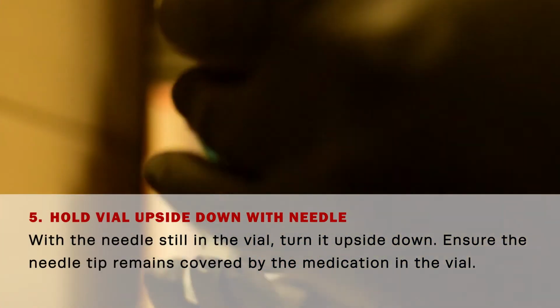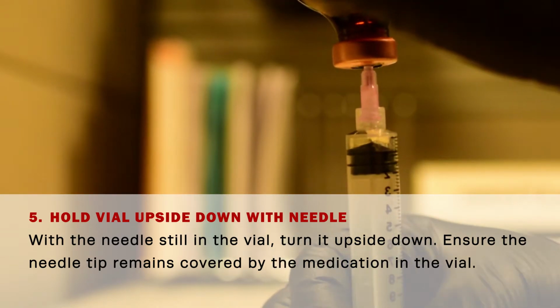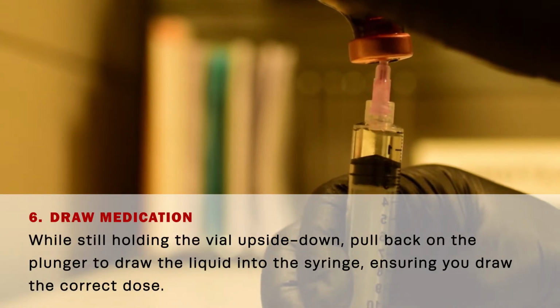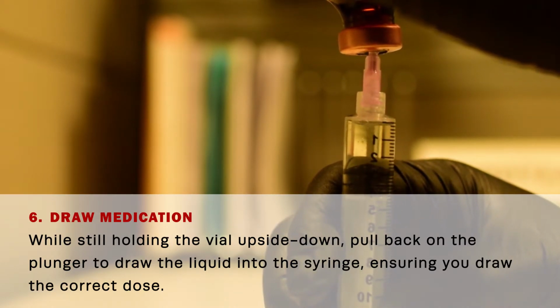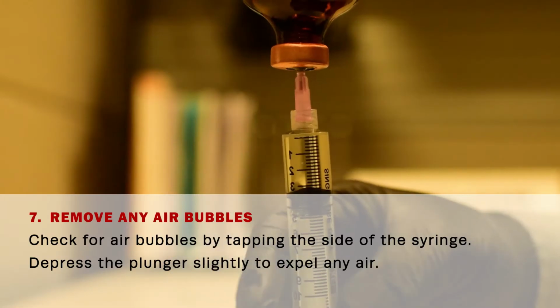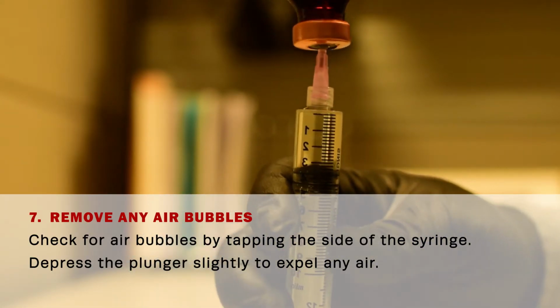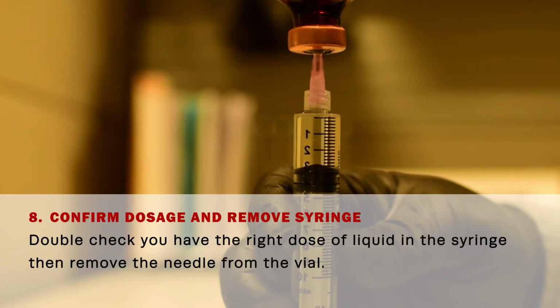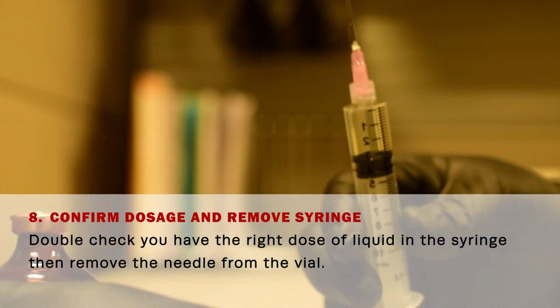With the needle still in the vial, turn it upside down. Ensure the needle tip remains covered by the liquid in the vial. While holding the vial upside down, pull back on the plunger to draw the liquid into the syringe, ensuring you draw the correct dose. Check for air bubbles by tapping the side of the syringe. Depress the plunger slightly to expel any air. Double check you have the right dose of liquid in the syringe, then remove the needle from the vial.